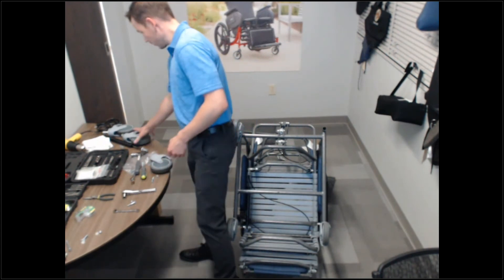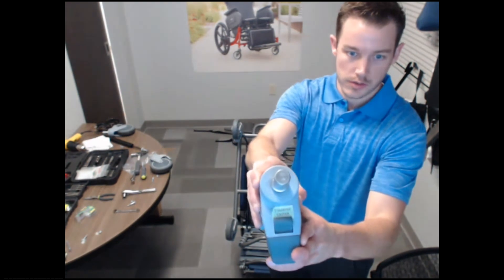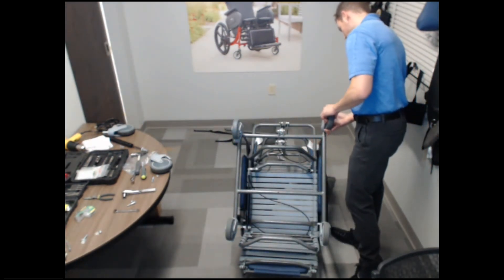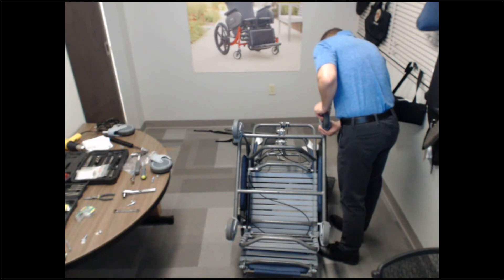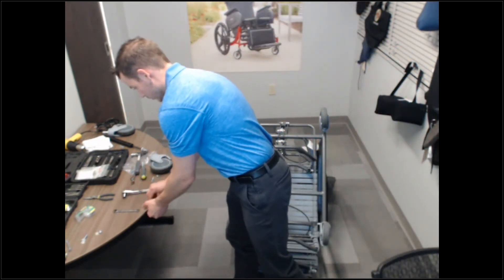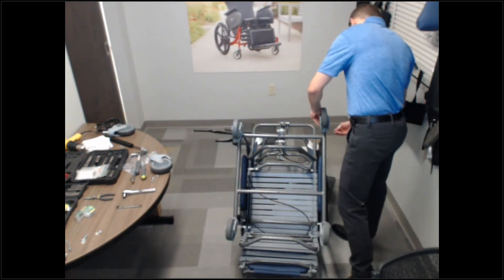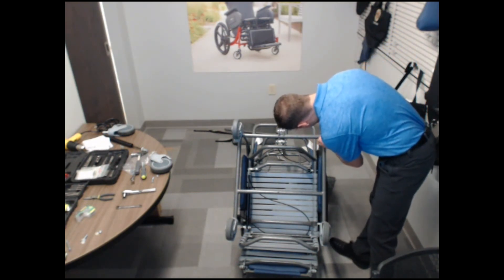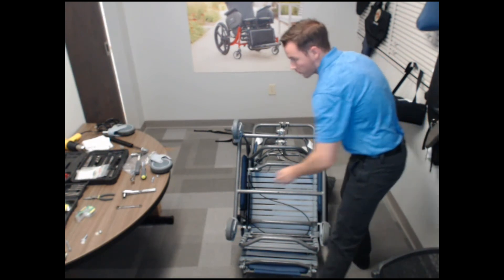There's my old one. And then this is a directional locking caster, or tracking caster. We'll put that on the right rear.